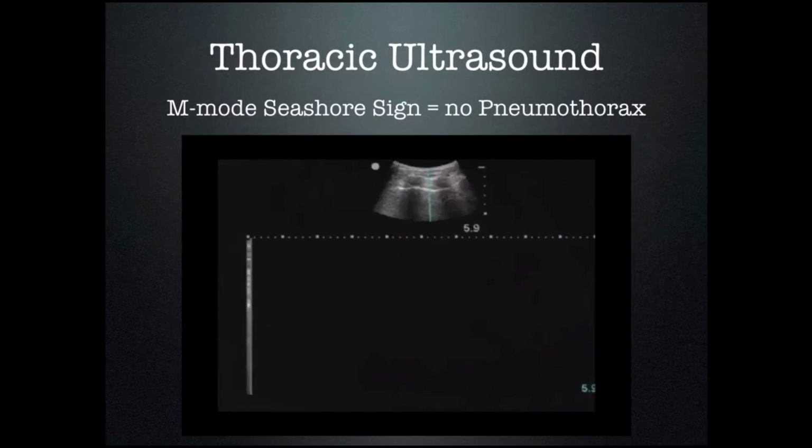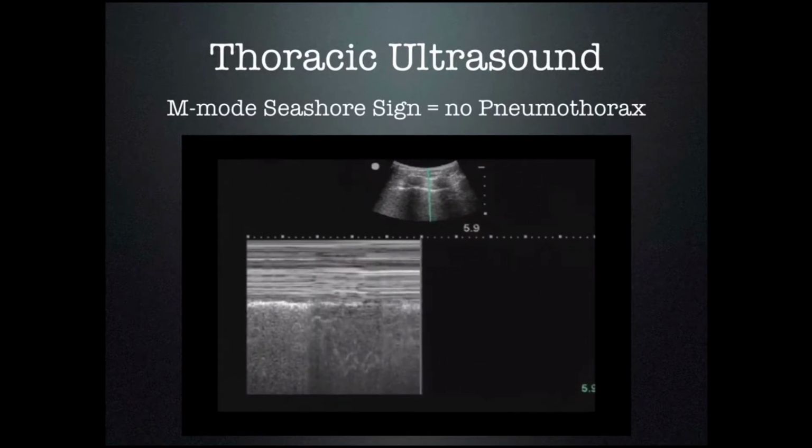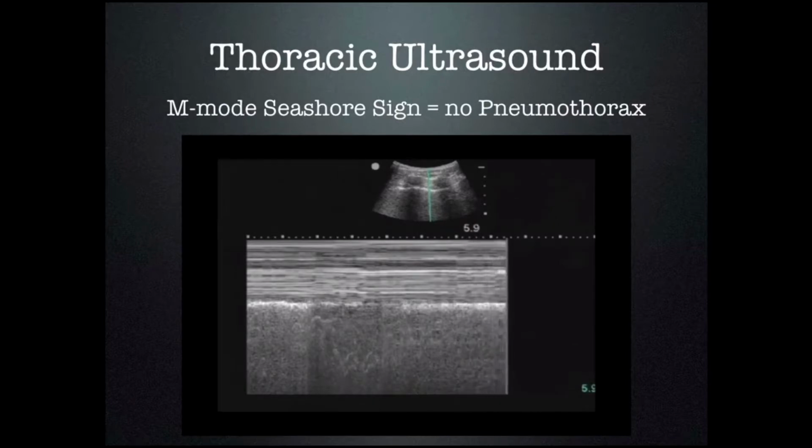One more time. Here's our probe through the pleural surface, and we can see the waves coming into the sandy beach, so this is not a pneumothorax.